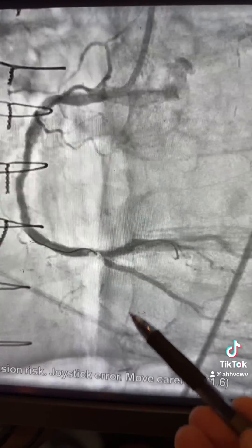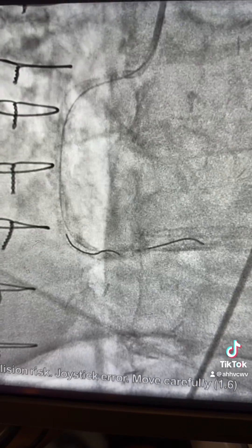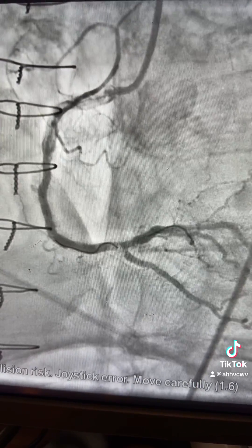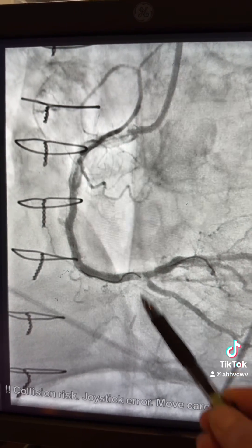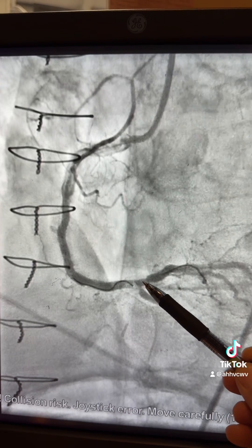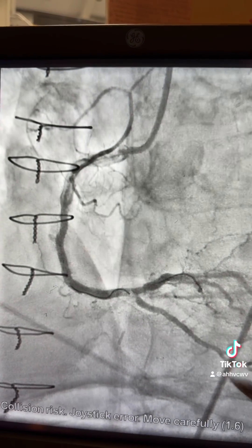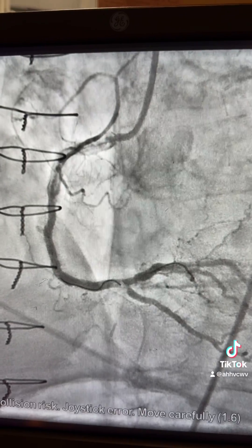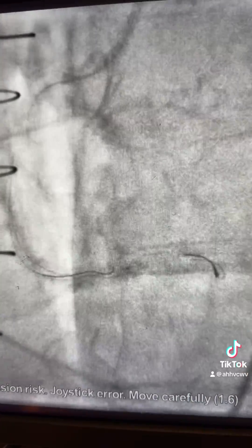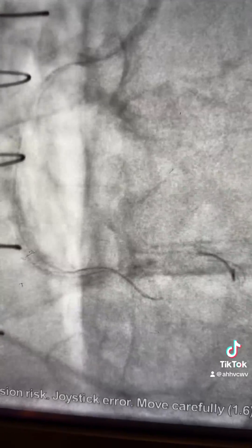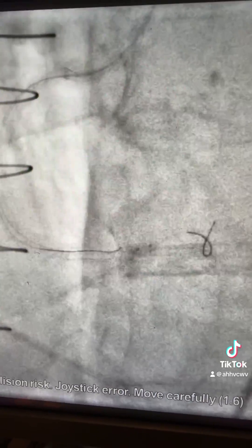Now, how to wire the PDA directly after this chunk of calcium: the tip here is to advance the balloon toward the PL, place the marker dot at the ostium, and inflate at nominal pressure to block that branch. Then manipulate the other wire through the side branch — the PDA. Here we are inflating a 2.25 by 8 balloon at the ostium and manipulating the other wire, which successfully went into the PDA.